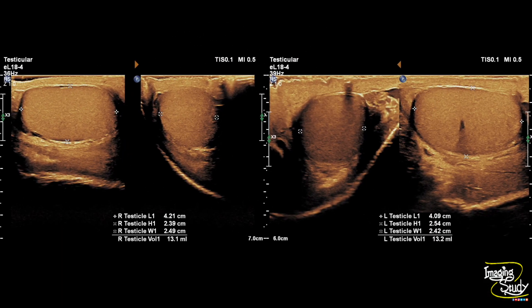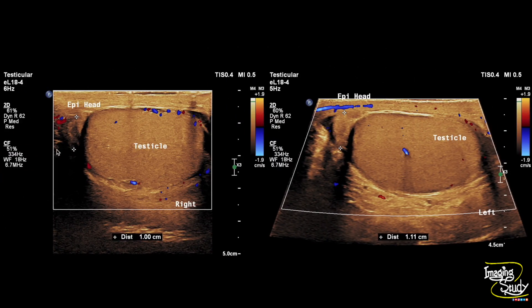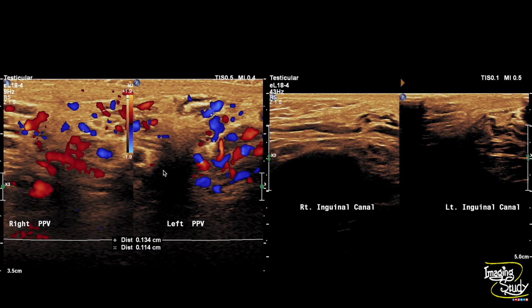Here we have checked the testes. The right and left testes are normal in size, shape, and position with uniform echotexture. No abnormal collection is noted surrounding the testes. Bilateral epididymises also appear normal. The pampiniform plexus of veins are not dilated and both inguinal canals appear normal.